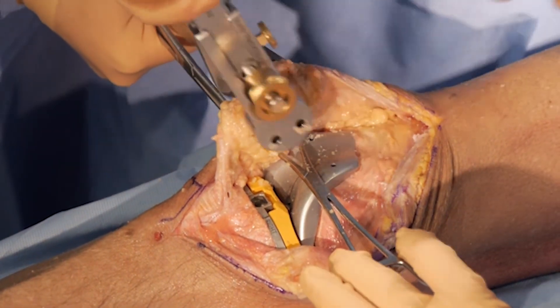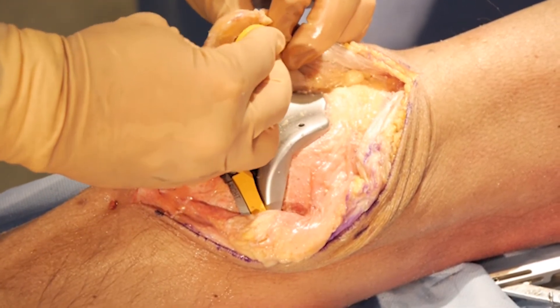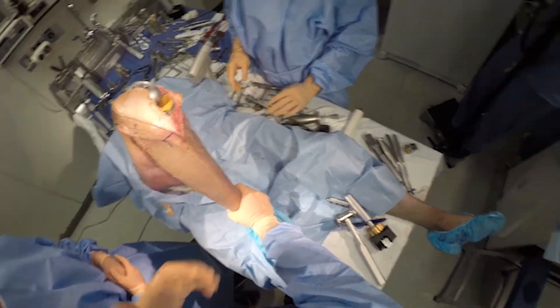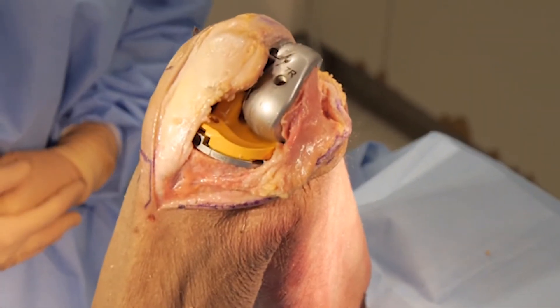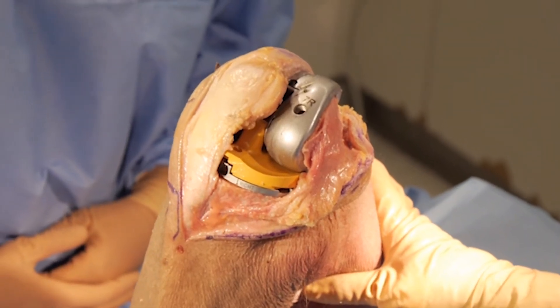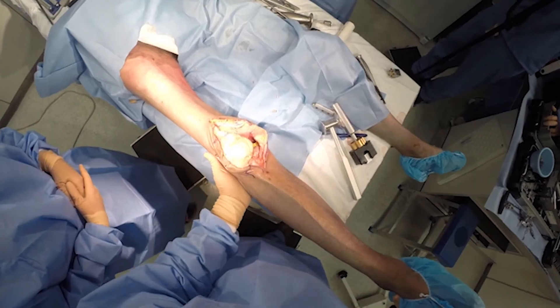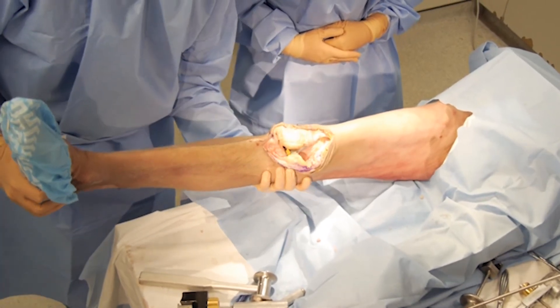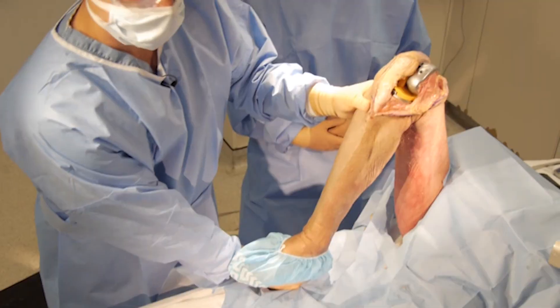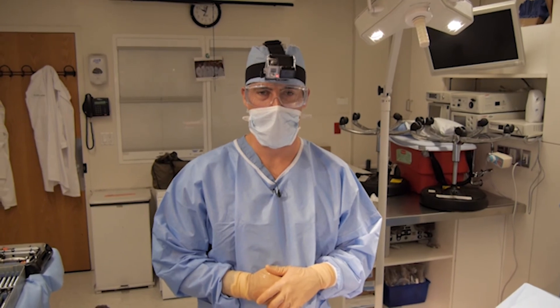This is my final check for patellar tracking. All retractors are now removed. I'll place my patellar button into position and check the final tracking — the patella is tracking nicely without any lateral pressure. If it weren't, I could do a lateral release or test with soft tissues using the sweetheart retractor. The knee is now complete. I check stability: it's nice and stable stressing the medial side, nice and stable stressing the lateral side, excellent patellar tracking, excellent flexion, and very nice stability in flexion as well. I'm Michael Cross, an assistant attending at the Hospital for Special Surgery in the Department of Joint Reconstruction and Joint Replacement.